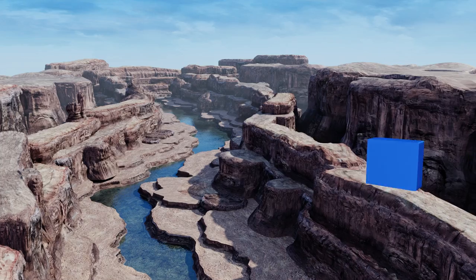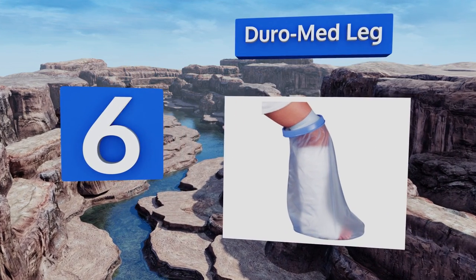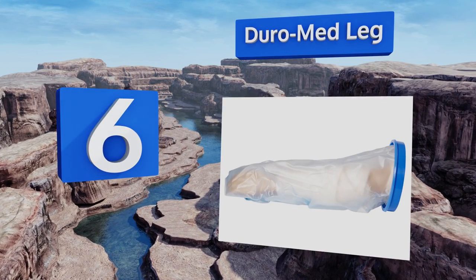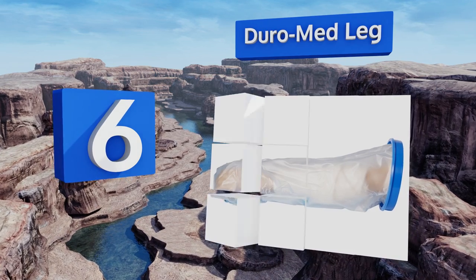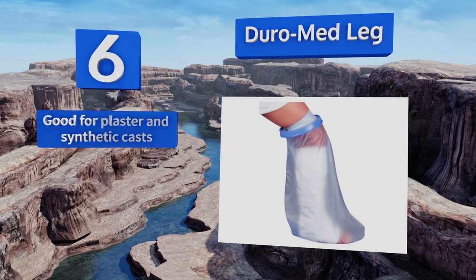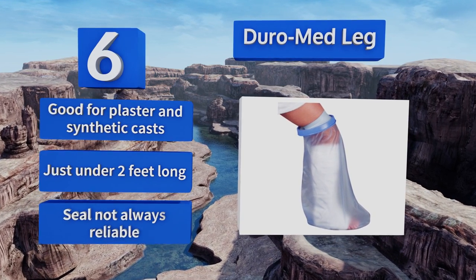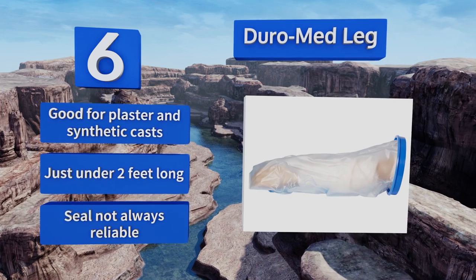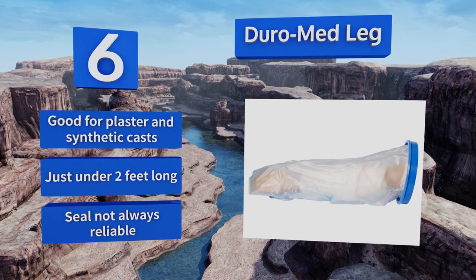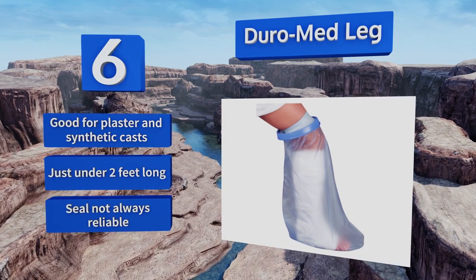Coming in at number six on our list, the Duro Med Leg is a great option for those with prosthetics or surgical wounds. People who have large boots might encounter some trouble when trying to fit into the fairly small hole in the seal, but the latex itself is easily manipulated to avoid edges or sores. It's good for plaster and synthetic casts and is just under two feet long, however the seal is not always reliable.